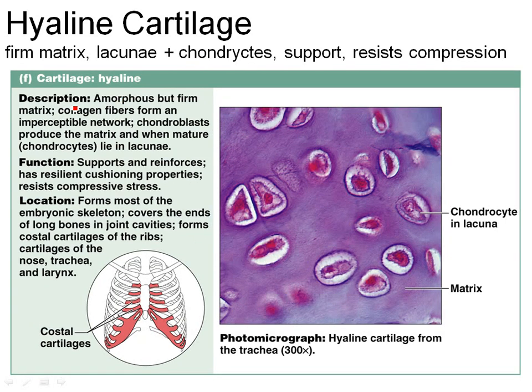Now we enter the world of cartilage. When you get into cartilage, you're now dealing with a matrix that's so thick and dense, you can no longer simply dissolve cells into it. So now you need a hole for the cell to sit in. The holes are called lacuna. And remember, now we're dealing with chondros. So this is a pretty mature cartilage, so it would be chondrocytes.